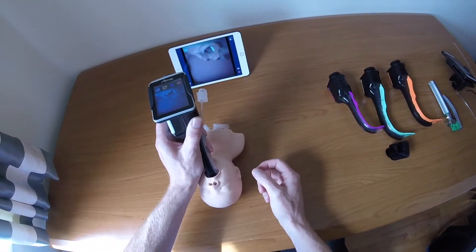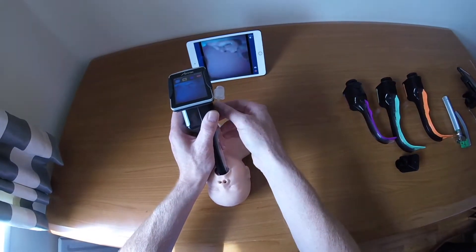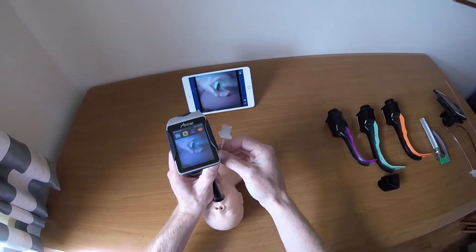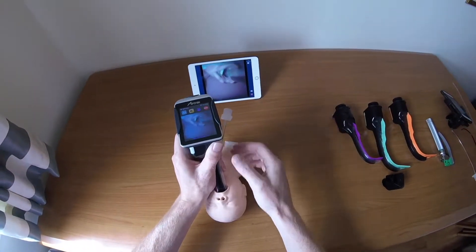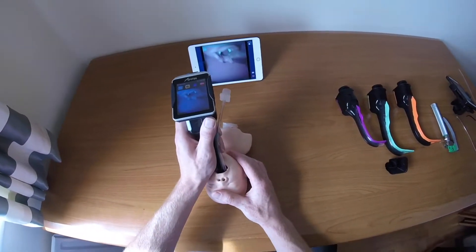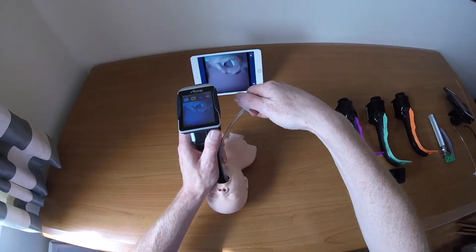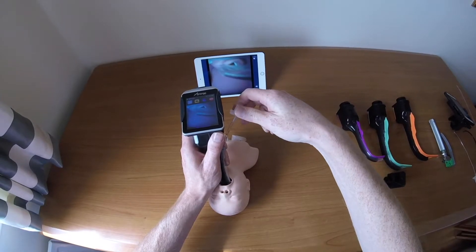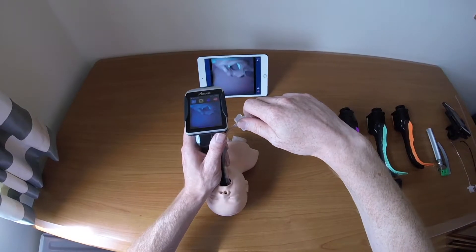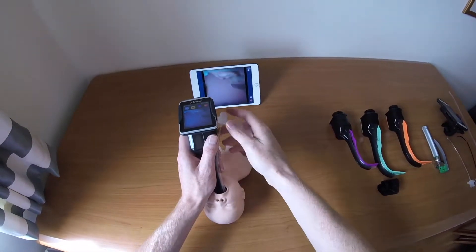Up and down adjustments are made with your left hand on the Airtrack itself. If you lower the Airtrack, advancing the tube will send it down; if you raise the Airtrack, it goes up. For left and right — counterintuitively, you don't twist the Airtrack in the channel. Instead, an anti-clockwise rotation at the top of the tube as you advance it moves it left, and a clockwise rotation moves it right.